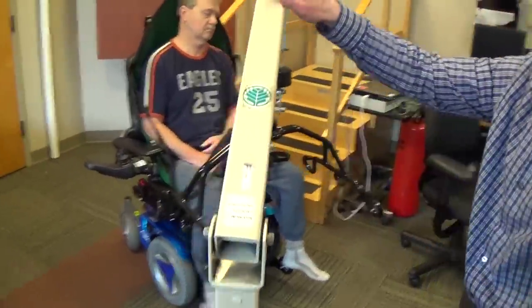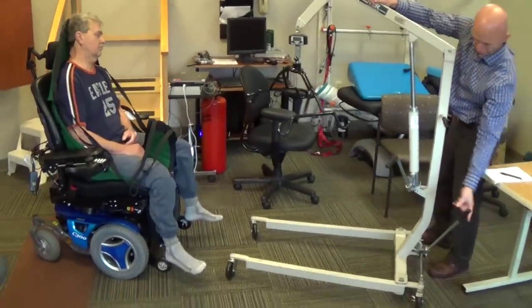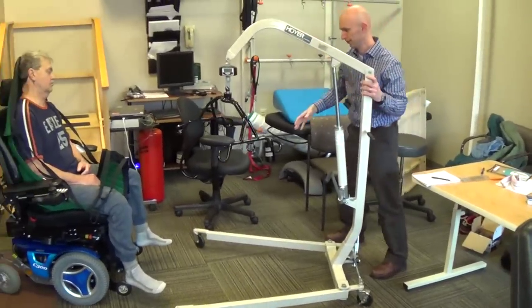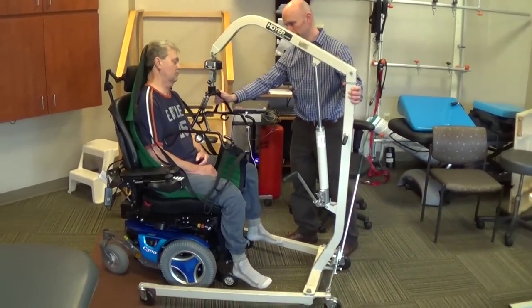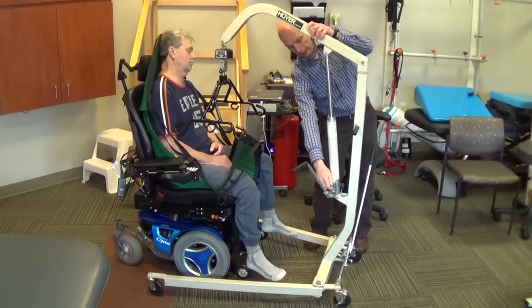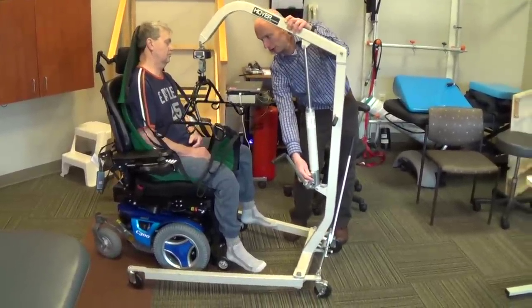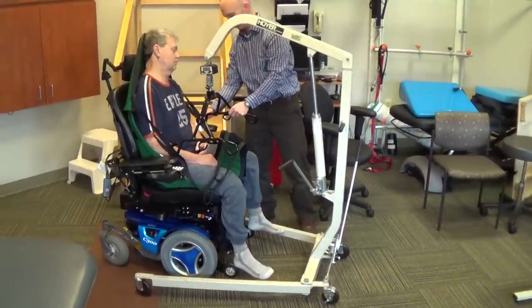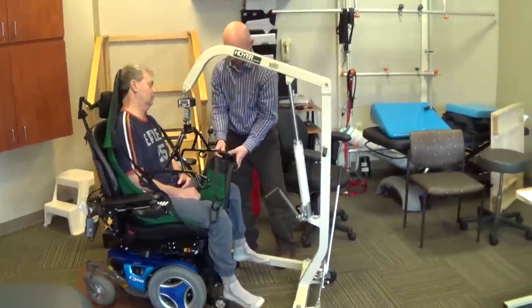And bring our lifter over. Next, I'm going to use the lever to open up the base of the legs to get around the chair. And you might be required to lower the lift arm just a little bit. I'm going to tuck both sets of loops through.